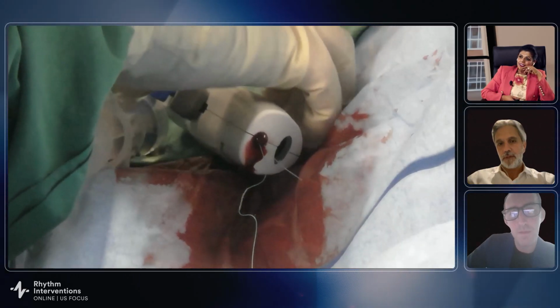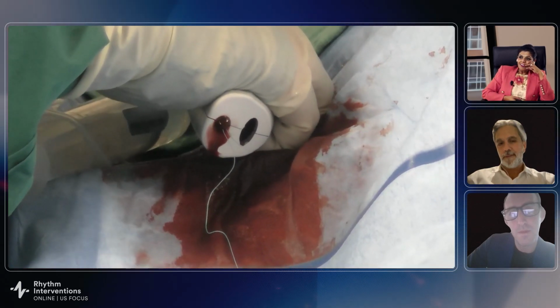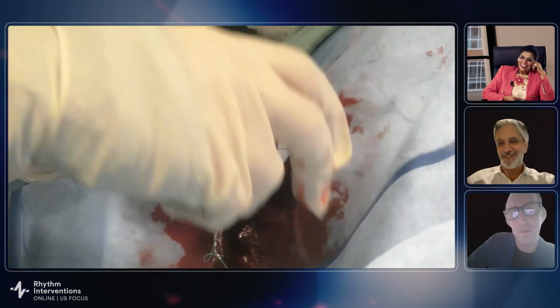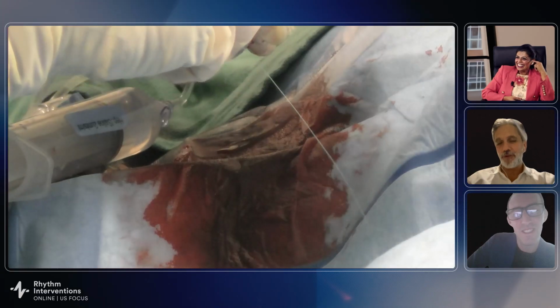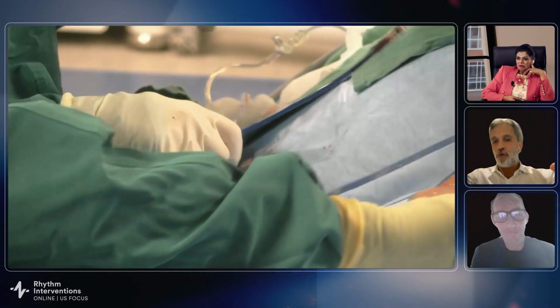I stand on the right side and move the eyes around because I'm just so right-handed. Not as skilled as you are. The issue is I always have to put the fellow between me and the X-ray, so I'm standing there. But no, we have changed our setup. And this was early on, but you're right. The table is sideways, like Nick said, and we're standing by the head more than here.